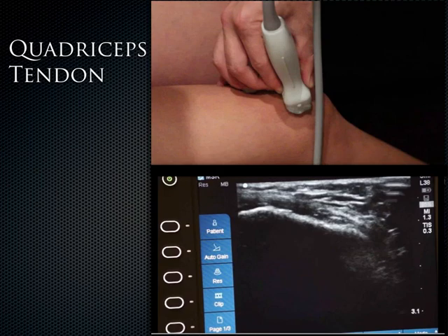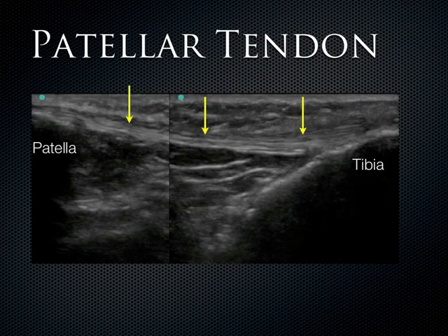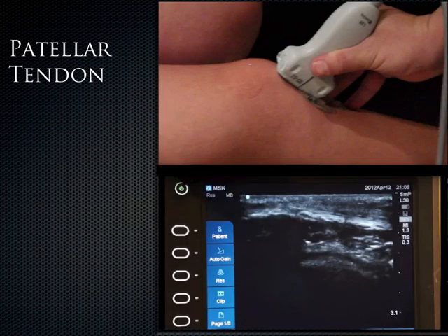Pretty easy to see. Okay, now what I did next was I wanted to see the attachment from the patella all the way down to the tibia down here. I couldn't get it all on one view. So I got this part of the tendon, and then this part of the tendon as it went onto the tibia. I basically stitched the images together here using the mask feature in Keynote. Really easy to do and kind of cool looking how it comes across like that. The patellar tendon seen there. And here's Alan describing how to do that a little bit better.